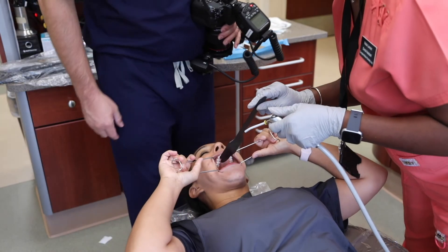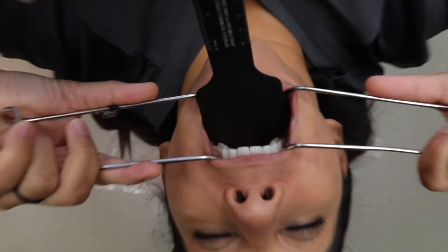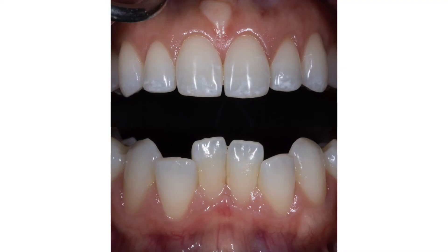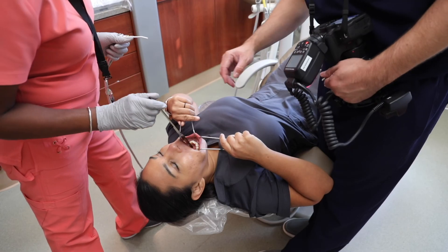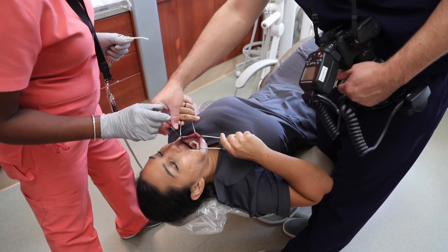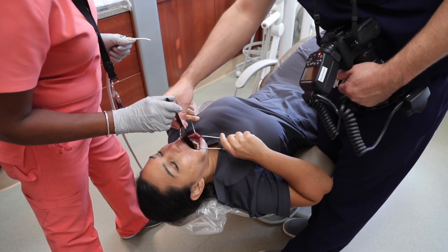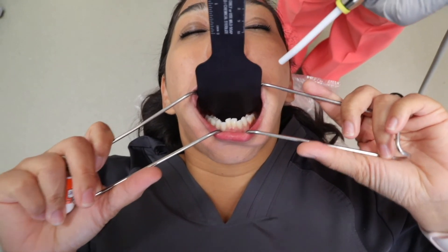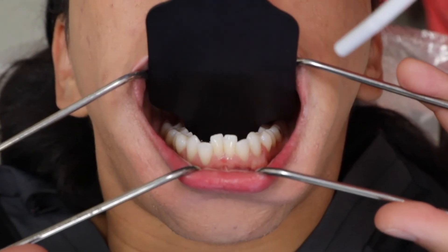These are two images that I take using a black contraster — one upper and one lower image. For both, I capture from canine to canine. The incisal plane should parallel the upper and lower border of the image, with the midline centered. A good focus point is the lateral incisor. The primary goal of retracting is to get the lip off the anterior teeth. The black contraster is placed behind the teeth to create a solid black background in the final image.